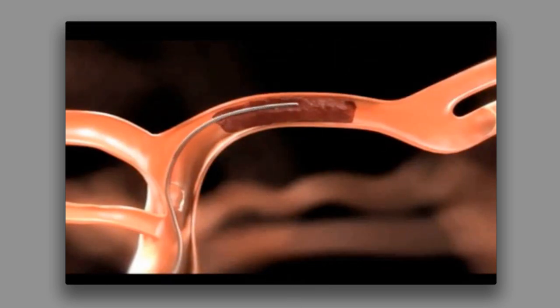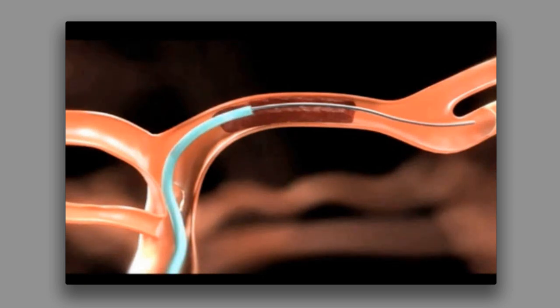In the first step of the procedure, a thin wire called a microwire is advanced up the arterial tree across the clot. This wire is used to advance a microcatheter, which is a long, thin plastic tube, also across the clot.